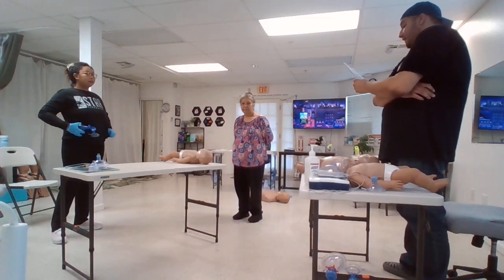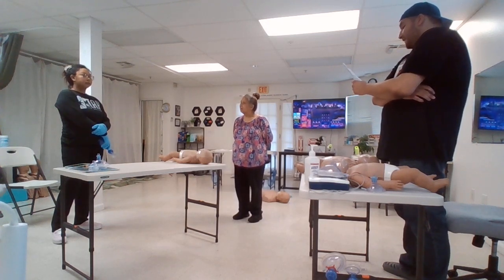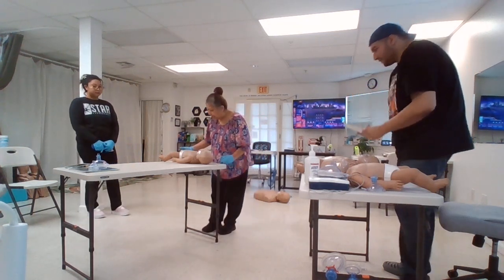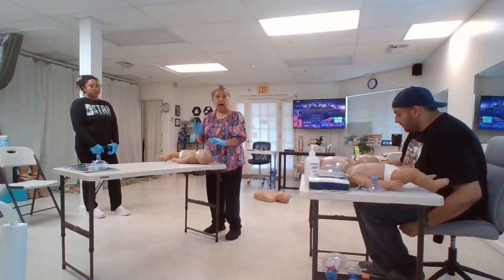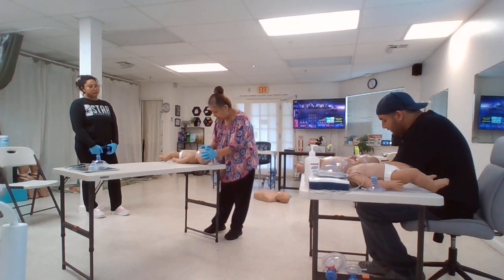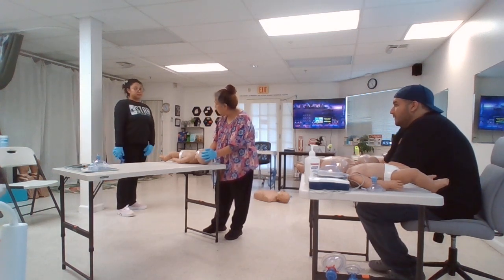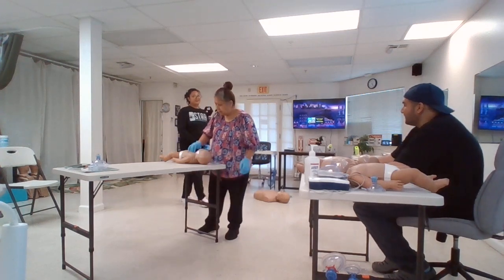So, you arrive on the scene for an infant who is not breathing. No bystander CPR has been provided. You approach the scene and ensure that it is safe. Demonstrate what you would do next. Hey, baby, are you okay? No response. Activate the emergency response and get an AED. Check pulse, 1,000, 2,000, 3,000, 4,000, 5,000, 6,000. No pulse, no breathing. Okay, I'll start CPR.